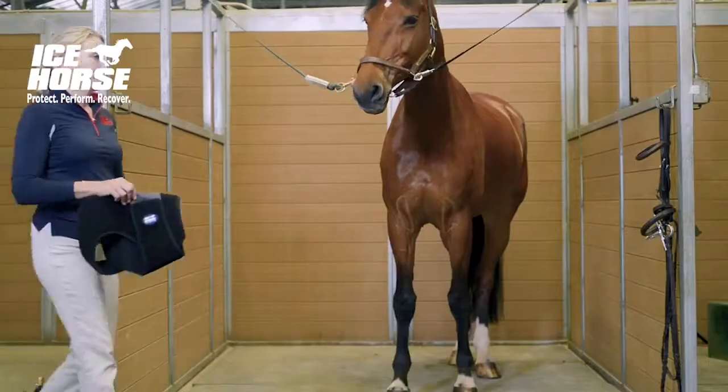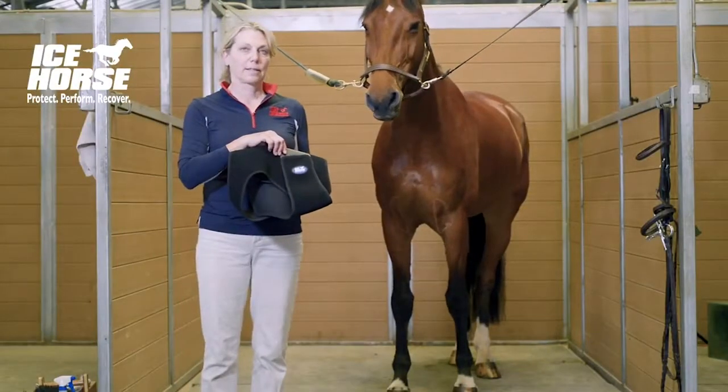This is the Icehorse Stifle Wrap. This wrap provides easy and effective treatment of the stifle joint.